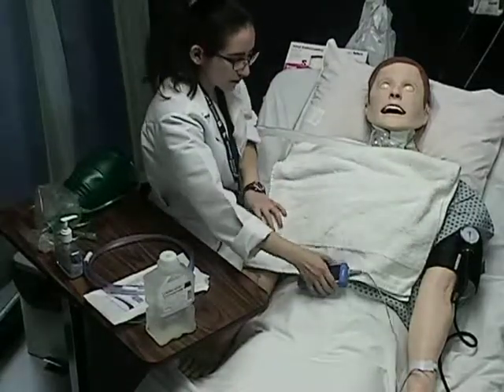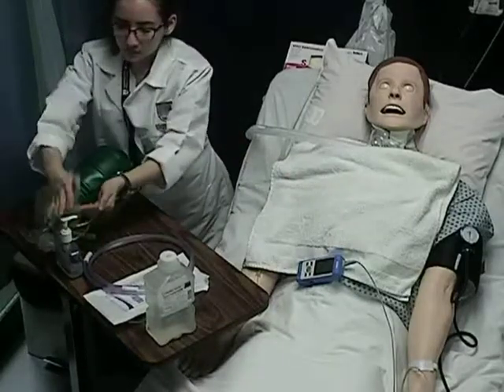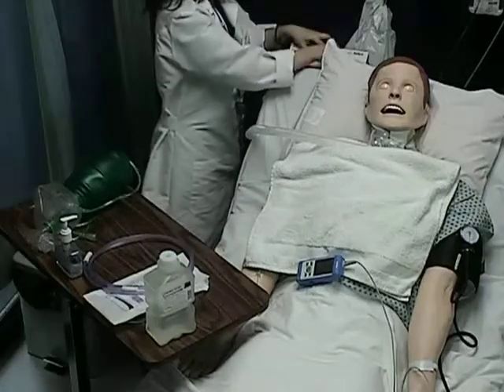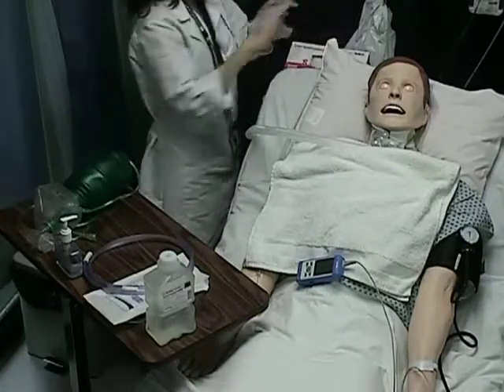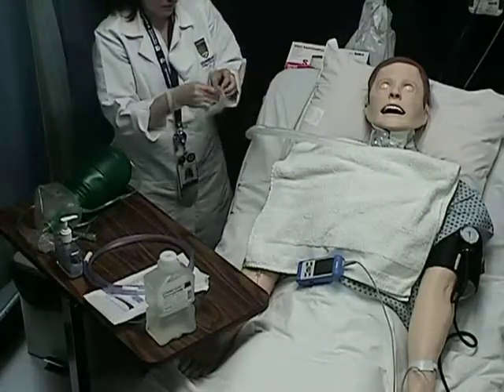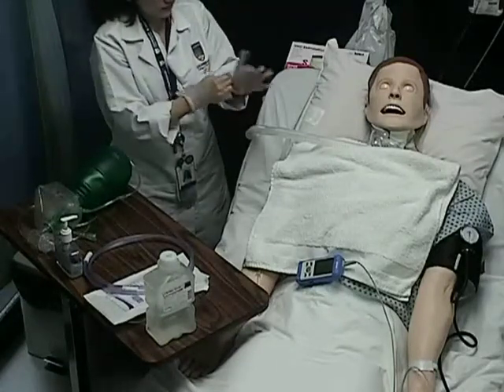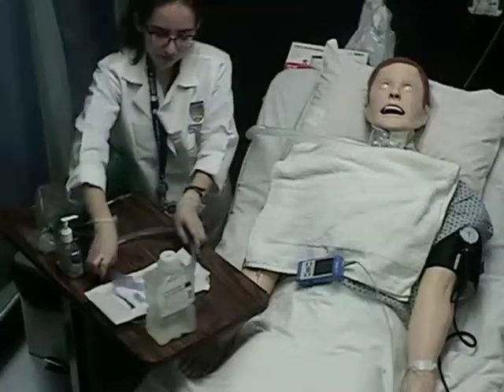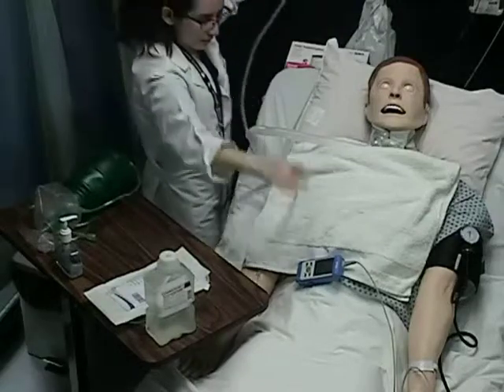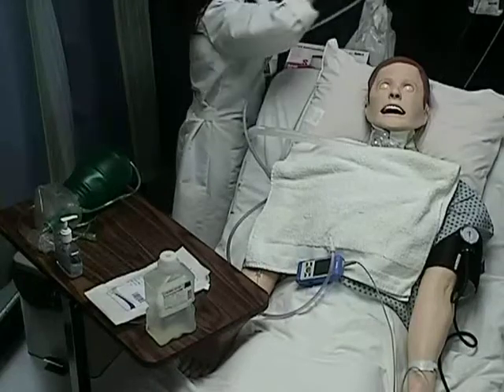Step 3, implementation. Perform hand hygiene and apply PPE if necessary. Your next step will include connecting the tubing to the suction machine. Place other end near patient. Turn on the device and set negative pressure appropriately.